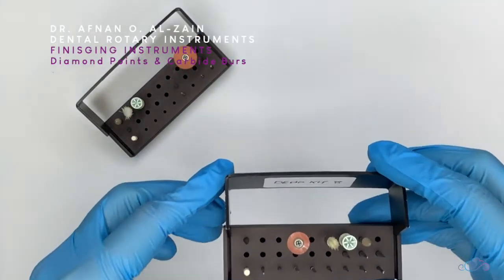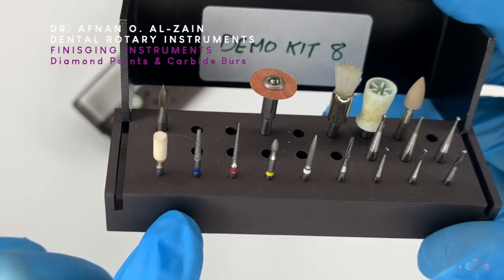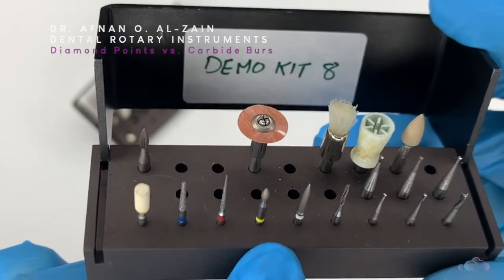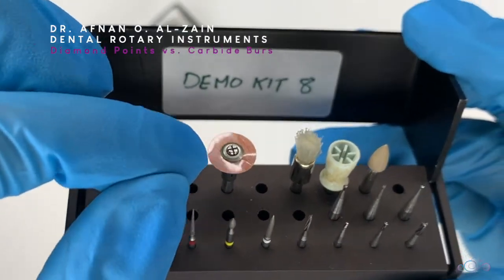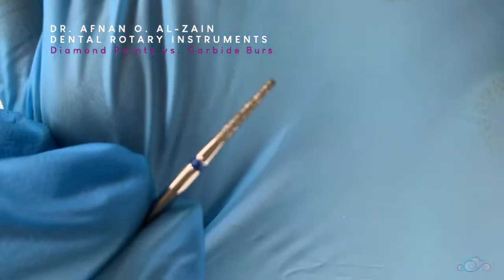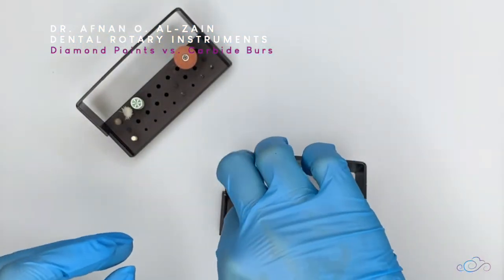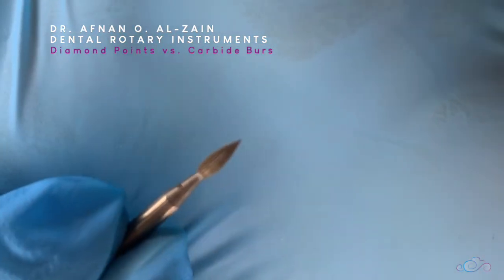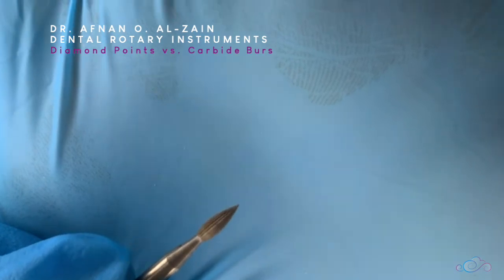Moving on to the finishing instruments. The finishing instruments can be either diamond points or carbide burrs. The difference between them is in the manufacturing: diamond points have a surface made from diamond particles, while carbide burrs have flutes. Both diamond points and carbide burrs can be either cutting or finishing — but this is the finishing carbide burr, and we're going to explain the details.